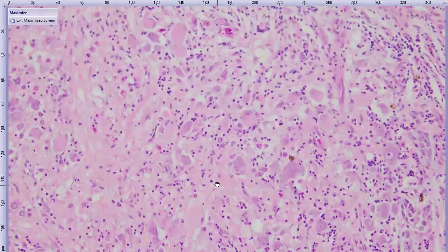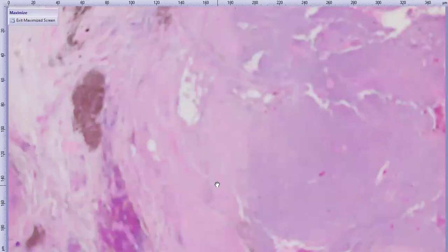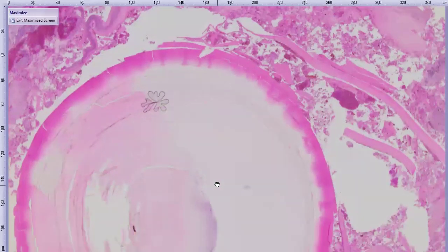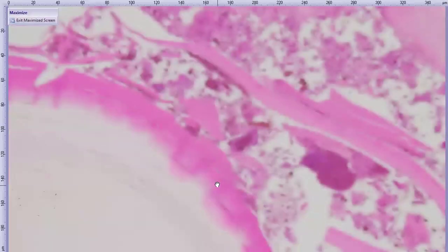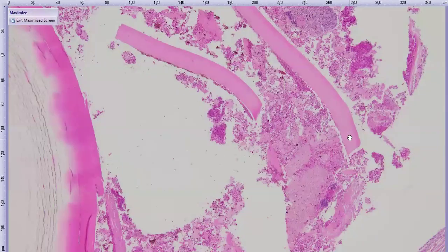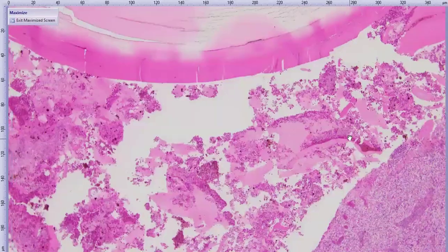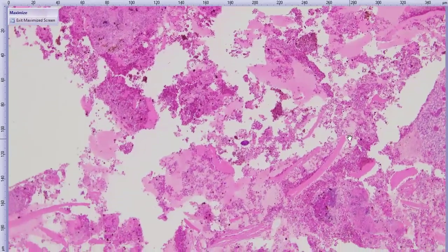And then we have some cleanup, some additional things for this fish. So if we walk up here to the lens, we do still have a normal looking nucleus, but the lens capsule is separated from the lens and the cortical fibers are fragmented. Some of this could be artifact, but the way that it's all embedded amidst all this tissue suggests there's probably some degree of true in vivo rupture and fragmentation of the lens fibers.